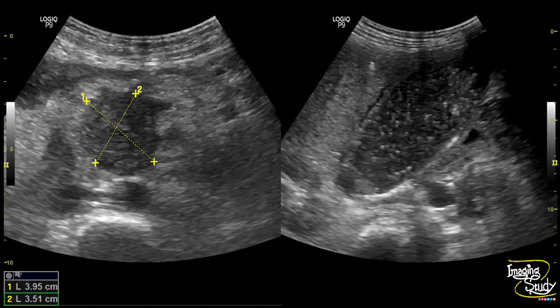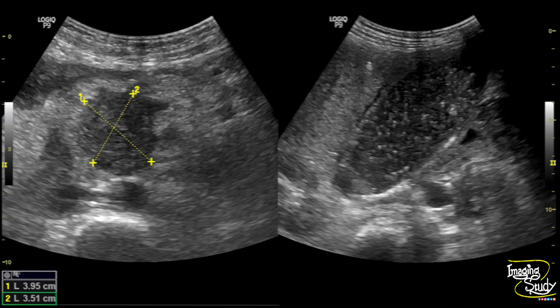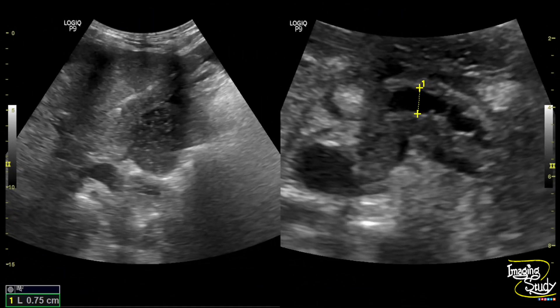Here again is the picture of the sludge-filled gallbladder. On the left image you can see the approximate measurement of the pancreatic head lesion. You can see surrounding hyperechoic thickening of the fat layer.